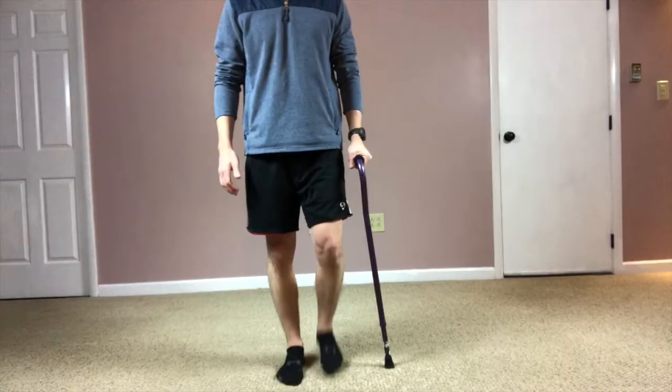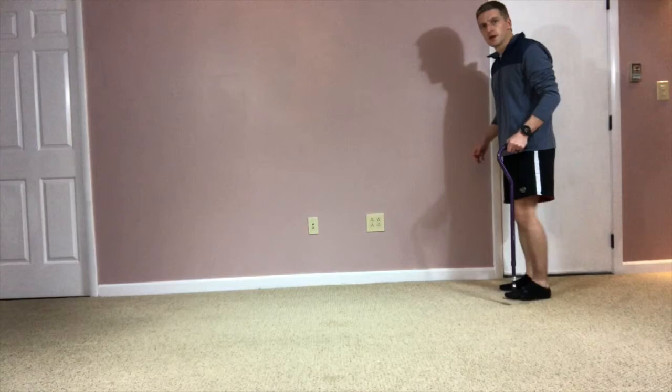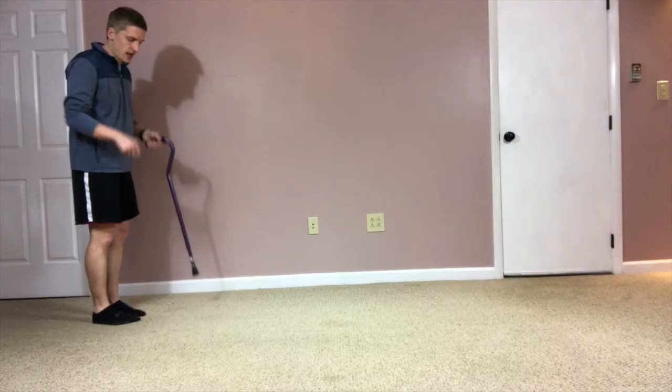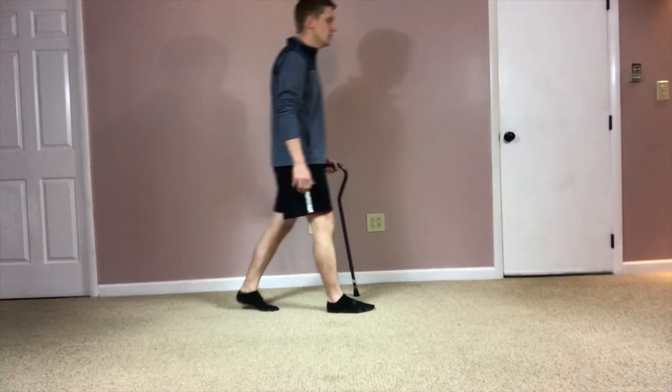I'll show you this from the side. Again, cane and surgical leg, other leg. One, two, one, two. A lot of people like to think about how many contact points. So two contact points, then one. Two, one. Two, one.